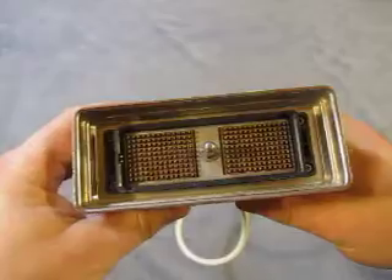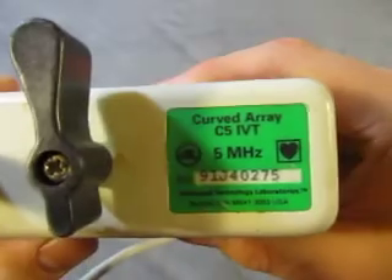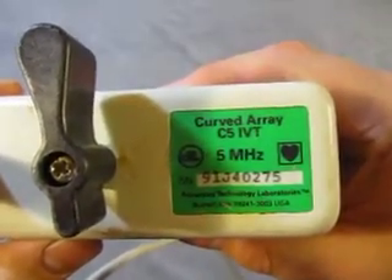There's a new connector — that's the type of connector it is. And this is a curved array, C5 IVT, 5 megahertz.